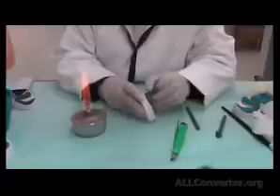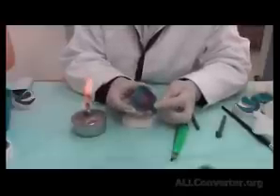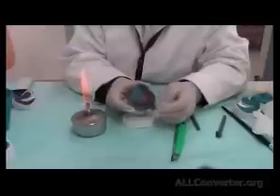If I take it out after it cools down, notice that it took an impression of the border, but at the same time it became matte. It's no longer shiny. Why did it become matte? Because it really touched all of the cast and the tissue inside the patient's mouth. And this is how I know that my material has reached the full depth of the sulcus.